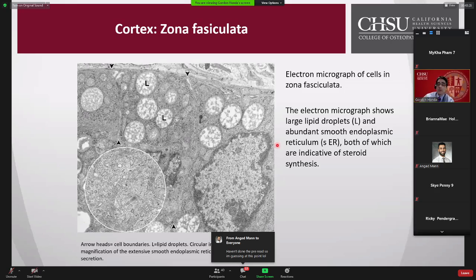So this is the example that's in the pre-read. This shows the lipid droplets. Instead of being absolutely clear, there's some tissue paper looking crumpled stuff in there. That's probably more common, the way lipids look. And you can see the mitochondria here, they're kind of elongated, with that cristae structure in it.